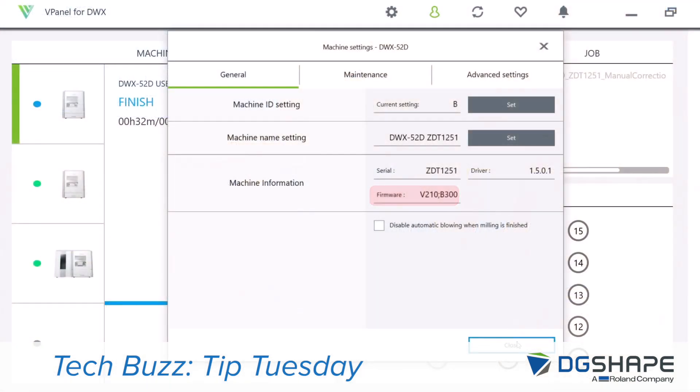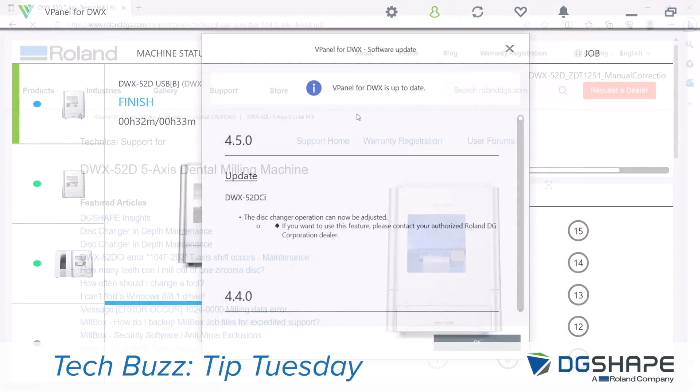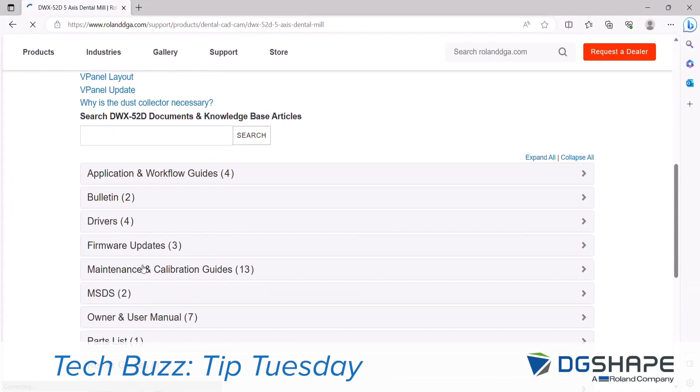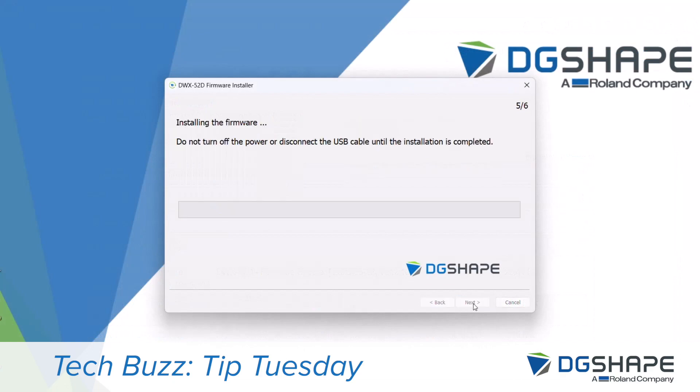I usually like to start by checking in vPanel that we have the latest version of firmware, drivers, and vPanel itself. If you need anything, go to our support page and download the applications that you need.